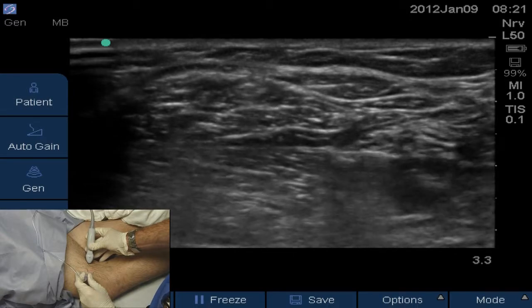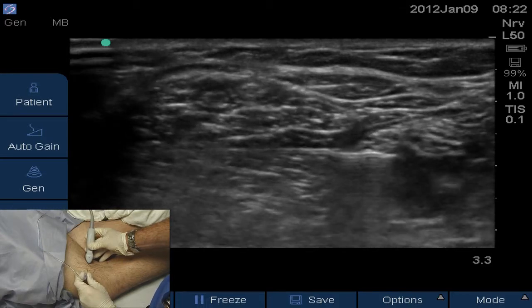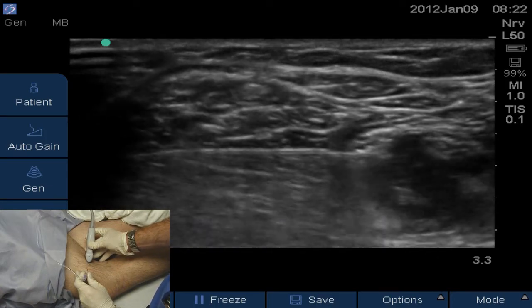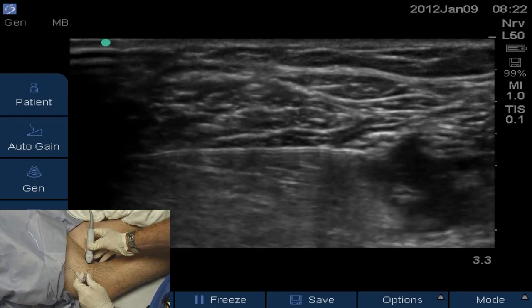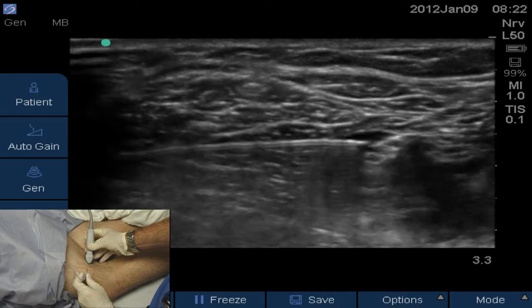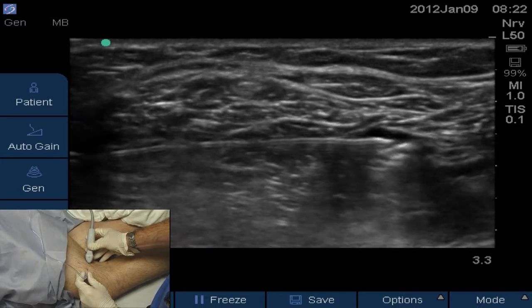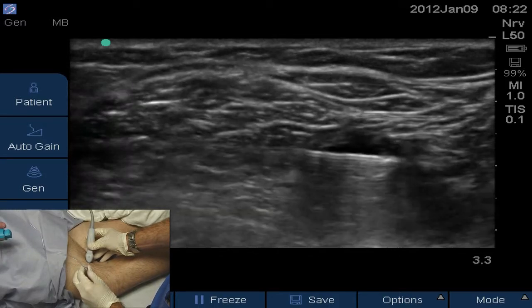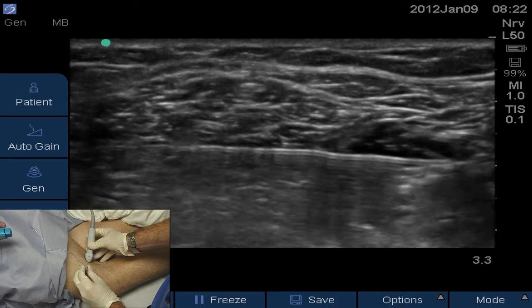We're in the spot where you're going to feel some pressure now. Another 5cc's there, just under peroneal. Let's see the nerves start to separate. 5 more — 20 left. We'll go 3 more, a little bit more towards peroneal, just pulling back the needle slightly. See how it flipped over the top of peroneal there? 3 more — I'm going to follow that injection, hydrodissect over the top of peroneal now. 3 more.